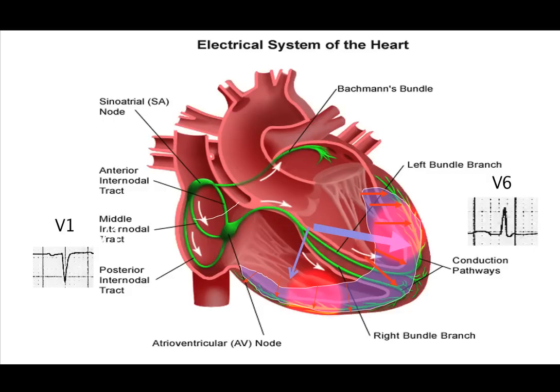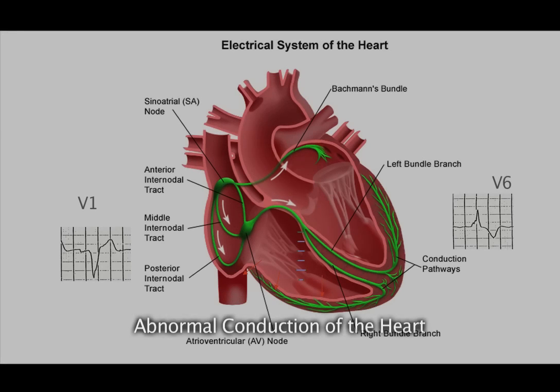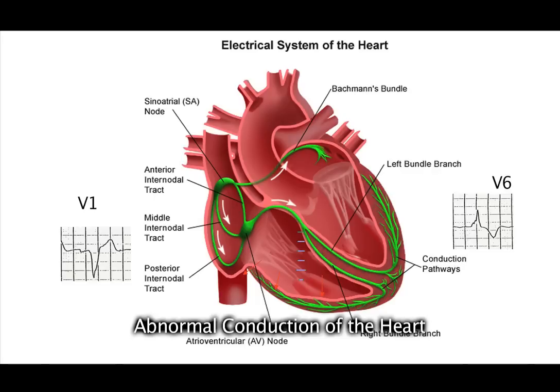If that happens, then your right ventricle will depolarize, the septal wall will depolarize, and the free wall of the left ventricle, the anterior wall, the posterior wall, all of that pretty close to simultaneously. And that gives us a really good snappy heartbeat. It gives us a good cardiac output because all the blood gets squeezed out at once. Now we'll talk about abnormal. With normal, the outcome of all that good snappy, fast conduction is a narrow QRS, and that's very ideal. That's what we want, narrow QRS.